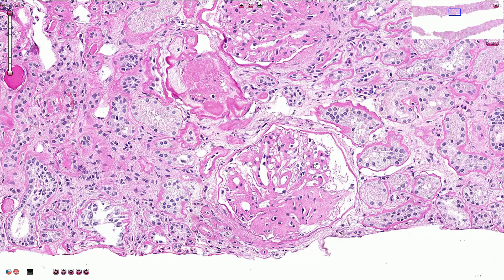Here we have the glomerular capillaries. This is the lumen of the capillary and this is the glomerular filtration barrier, which is responsible for blood filtration and primary urine formation.